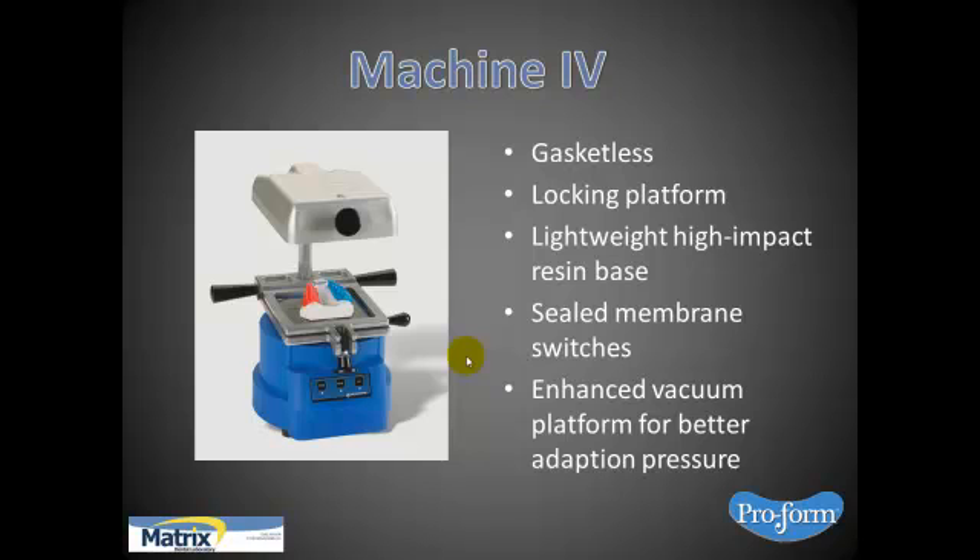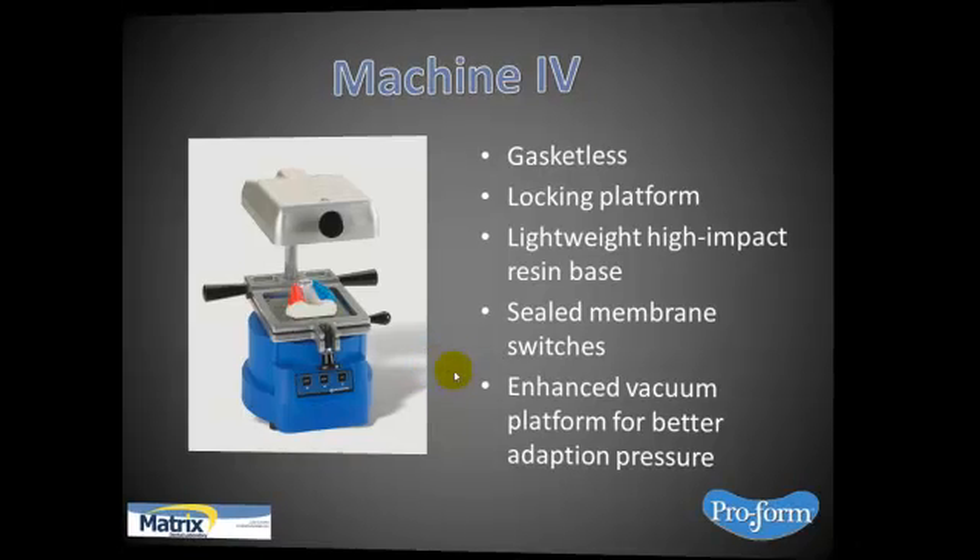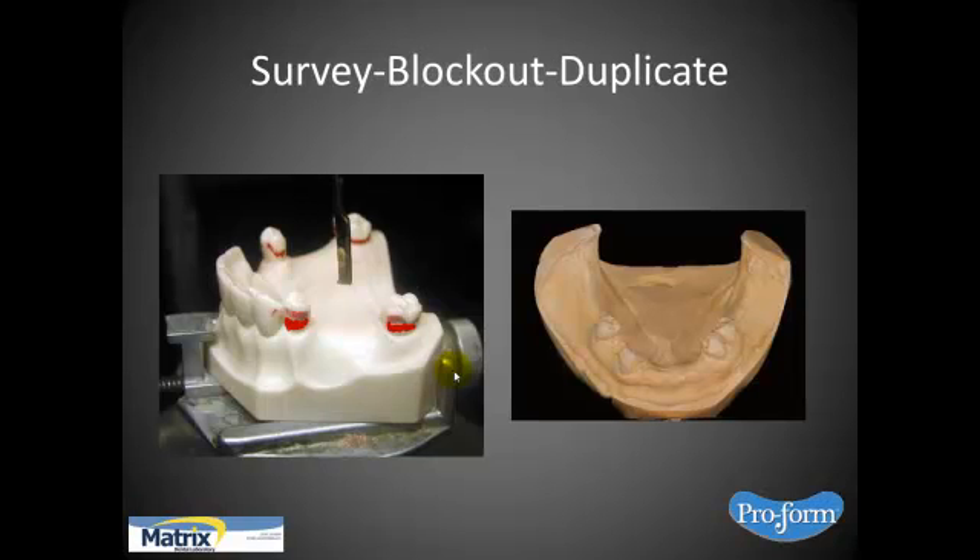Look into a good machine — and again, for all of these types of products to work, you have to have good technique. So quickly: you would like to survey and block out the master model, then duplicate it. You'll be working off a duplicate with the blocked-out undercut. Some prefer to leave a lot of undercut, some prefer a little — it really depends on what's available, and you go from there.